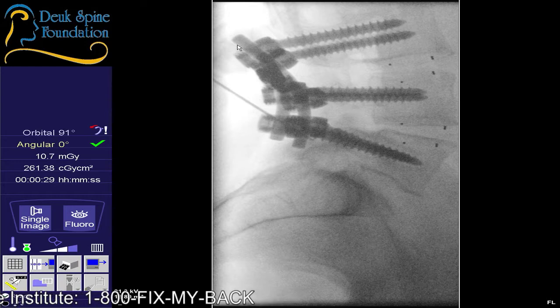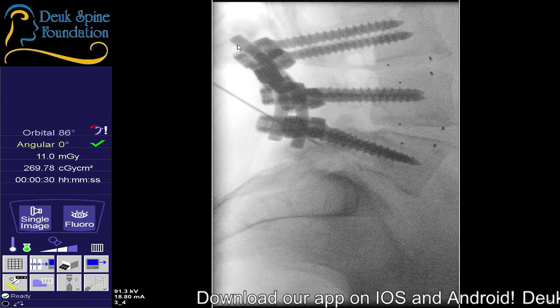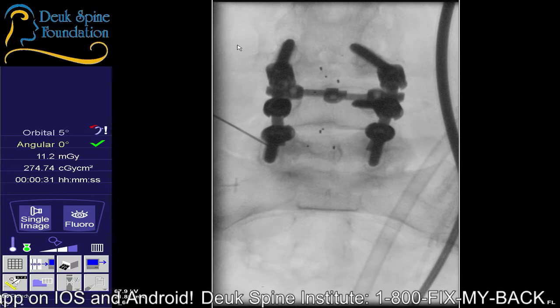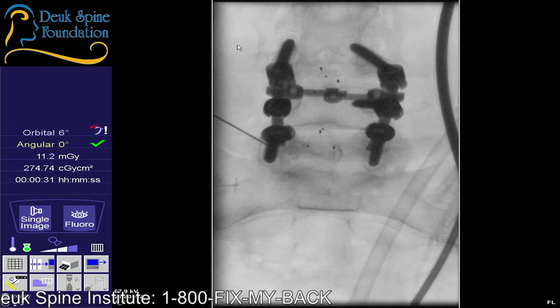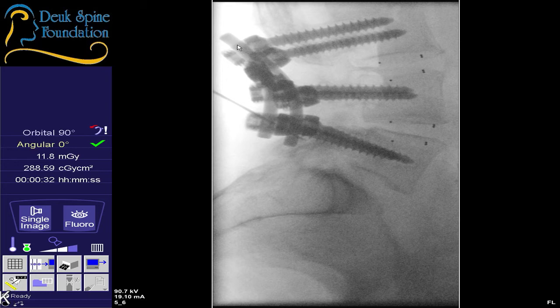Where do you feel that? I feel that right there. In your back? Yeah. All right, shot. Shot. I feel that down my leg. Down your leg? Down my left leg. How far down? All the way down to the toe. Give me an AP. Well, the good news is we're nowhere near your nerve. Good. And lateral. Yeah. We're a mile away.